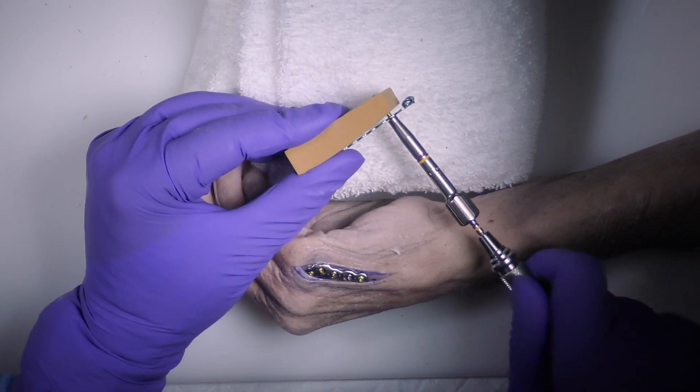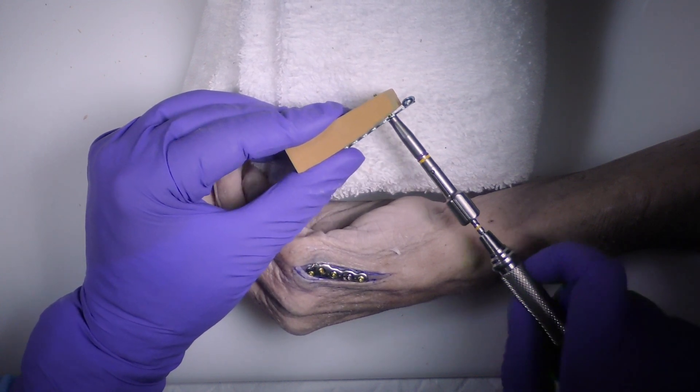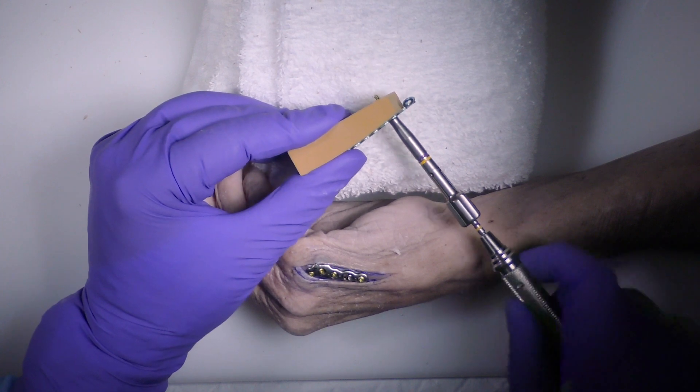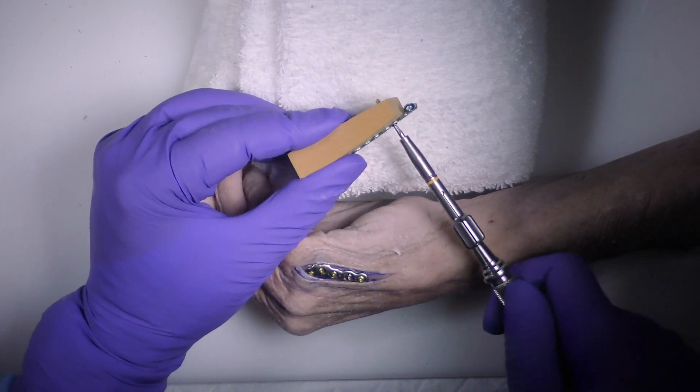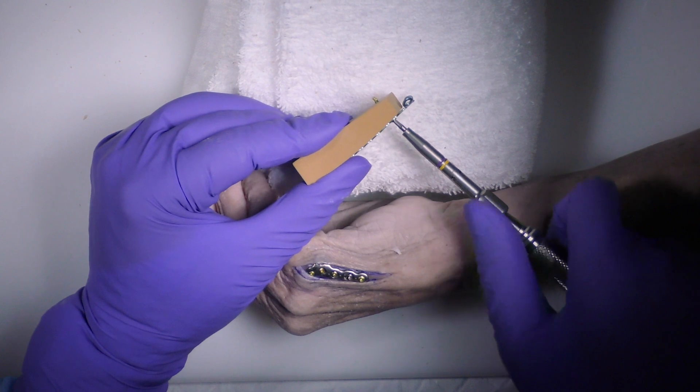But now that I'm blocking those screw heads with the save lock, it's going to drive the plate down. I get my fixation there, and I can pop this off or spin it off.